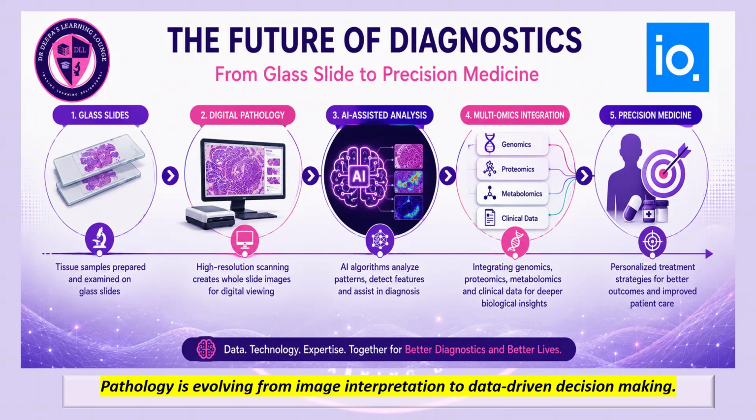That is computational pathology, which has gone ahead of AI also. AI enables us to combine all these data sets into a comprehensive understanding of the disease. That is where computational pathology is today. So this integrated approach basically supports what is called precision medicine, where the treatment decisions are tailored to the unique biological characteristic of the patient's disease.